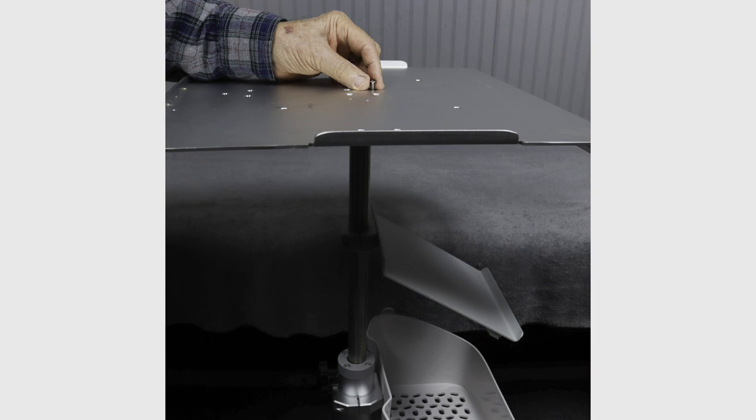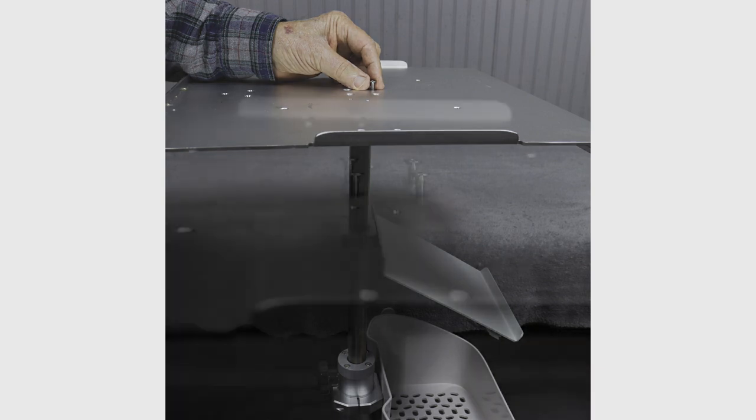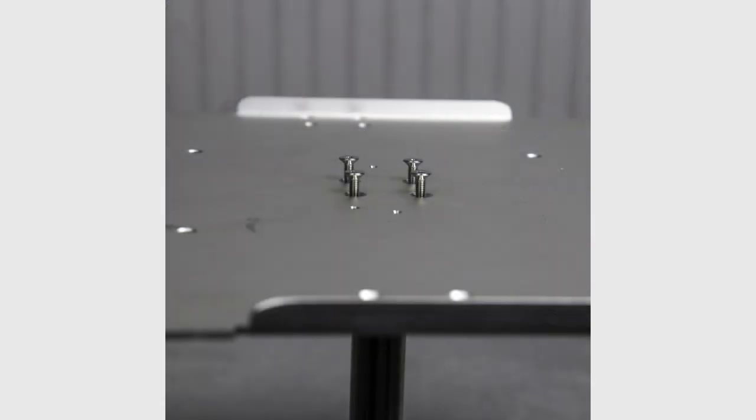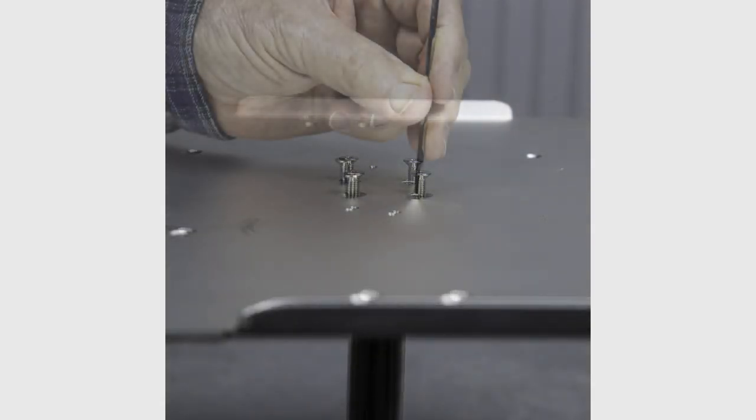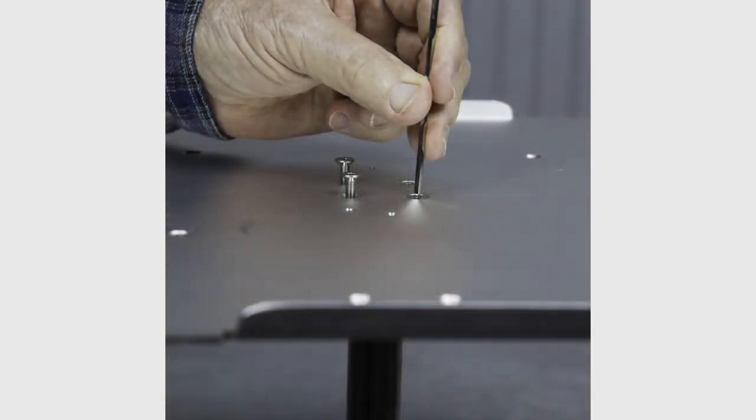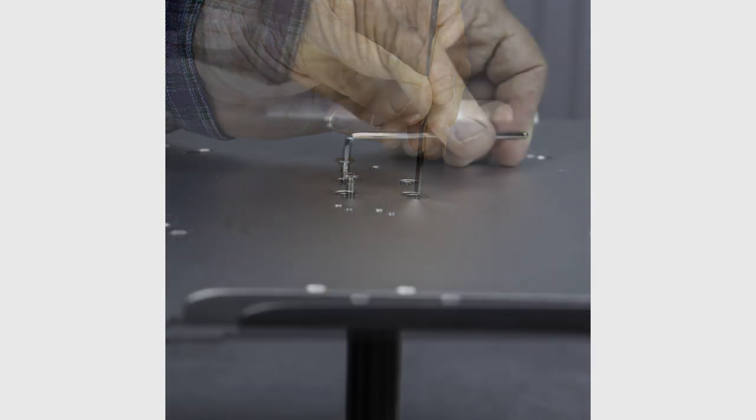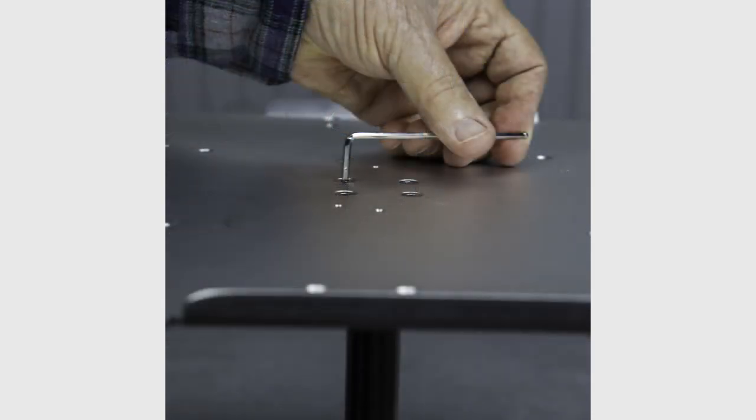Hand start each of the four screws. Continue screwing in each screw with the long end of the small Allen wrench. Finish tightening with the short end of the Allen wrench until snug and then tighten an additional quarter turn.